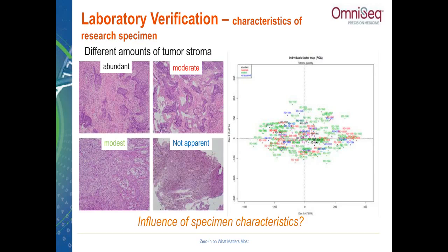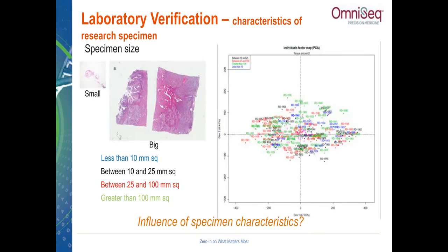We looked at specimen size. We actually measured the specimen size and put it into specimens that were less than 10 millimeters square, between 10 and 25, 25 to 100, and then greater than 100 millimeters square.